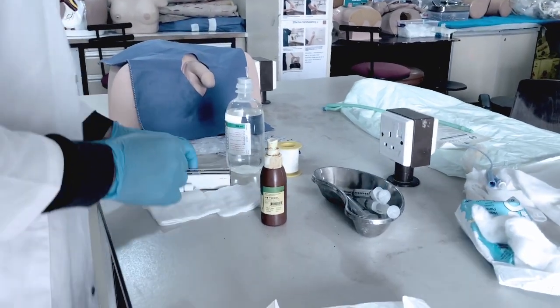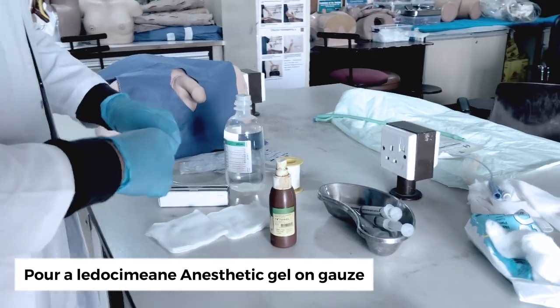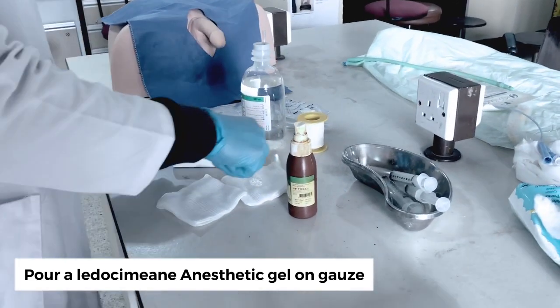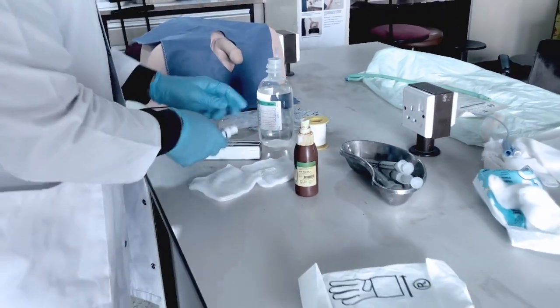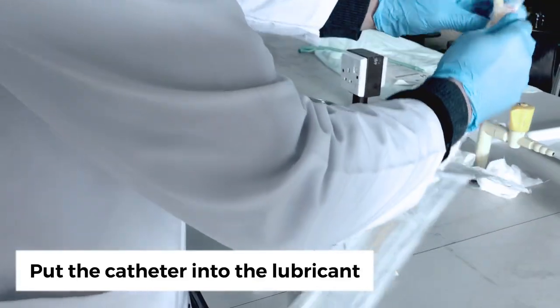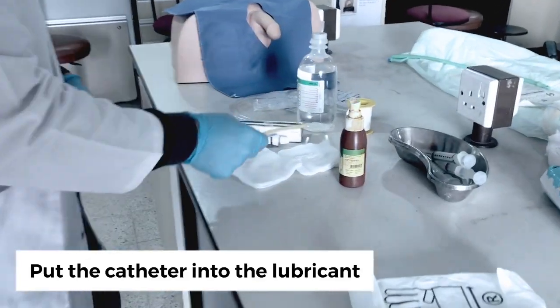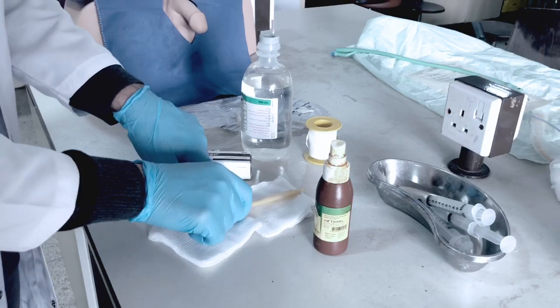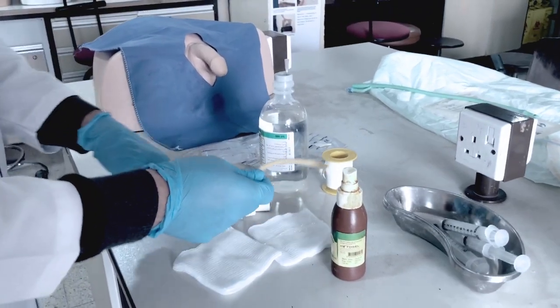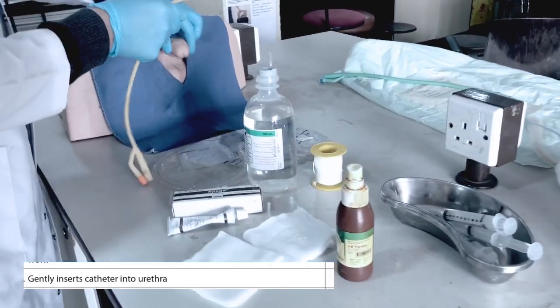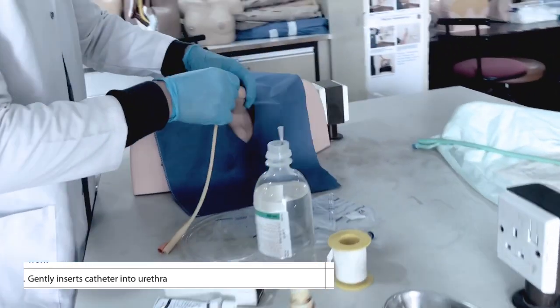After that, then we gently insert until the urethra.